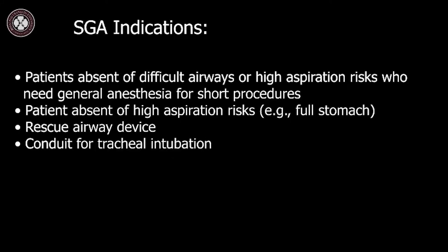The following information provides evidence-based step-by-step guidelines on how to properly perform insertion of a supraglottic airway device, commonly referred to as SGA. This video pairs with the attached fluency.